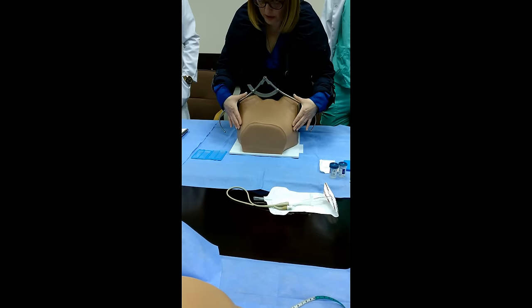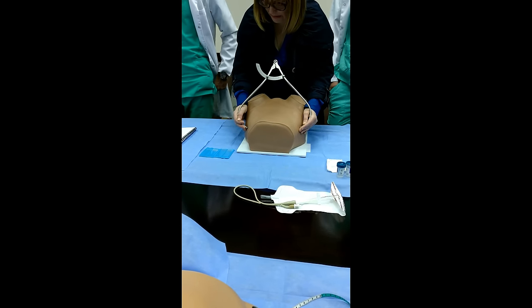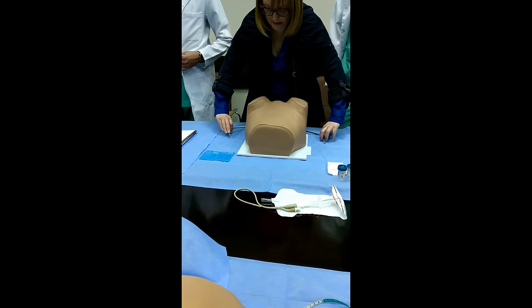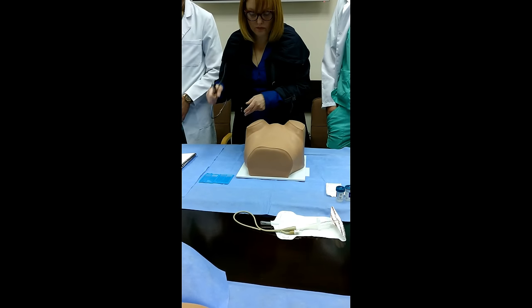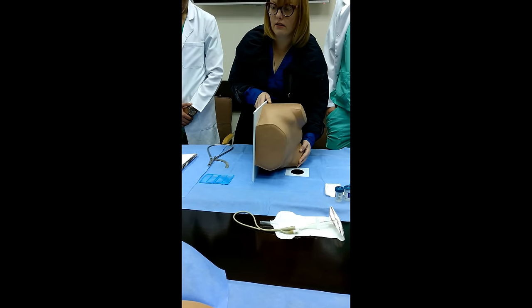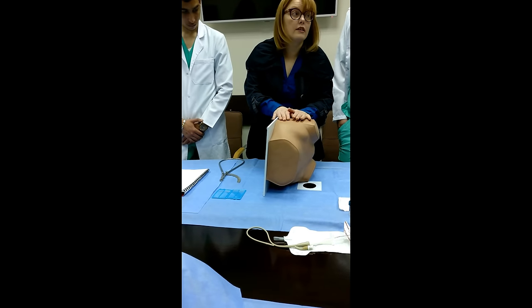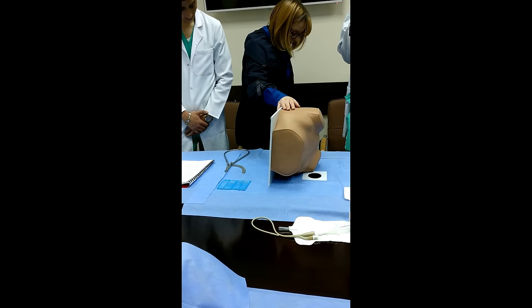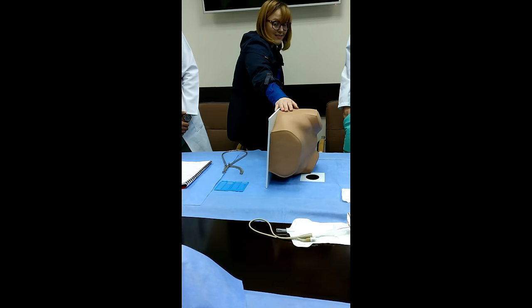The second is the intercristal diameter, between the crests, the farthest points of the iliac crests. We palpate the crests, the farthest points, and we apply the pelvimeter. The third one is the intertrochanteric, between the trochanters. We apply it. After that comes the external conjugate. The patient should lie on the right side, with the inferior leg flexed and the superior leg extended.